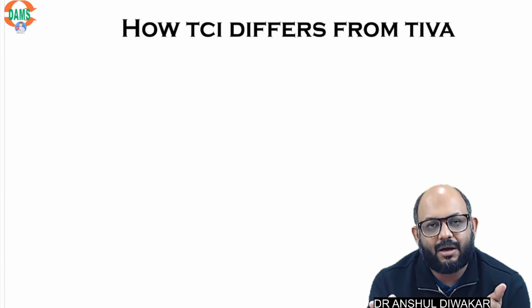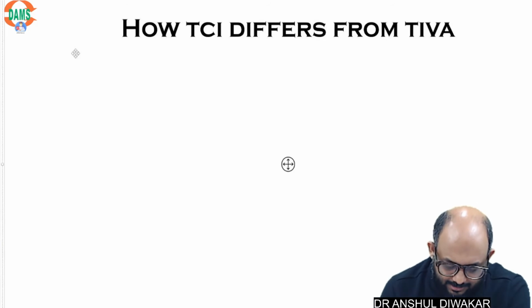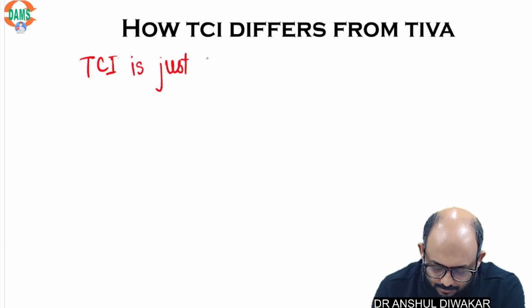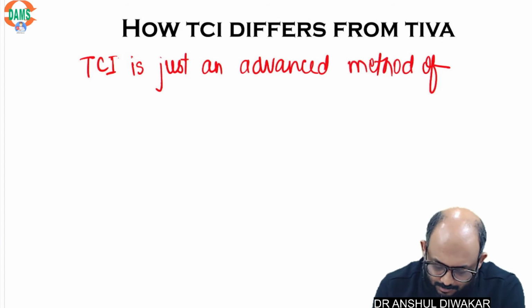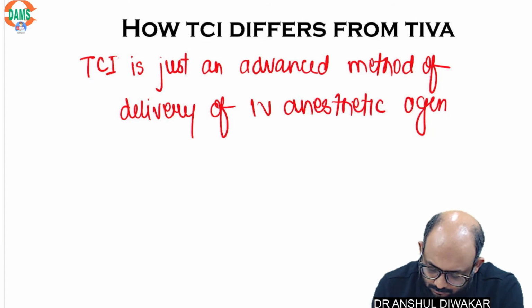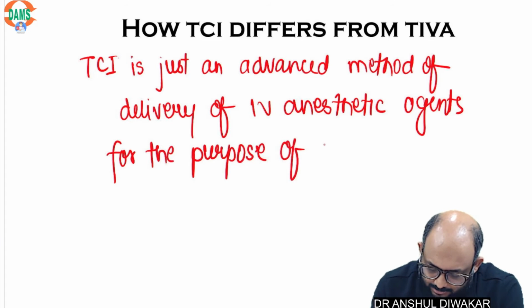When you give TIVA using an advanced method of delivery of IV drugs, it is called TCI.